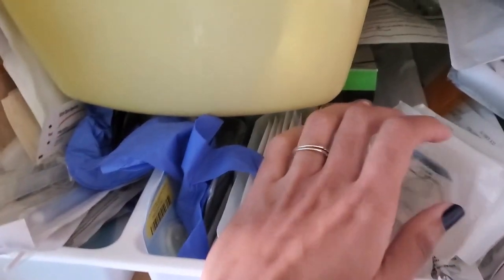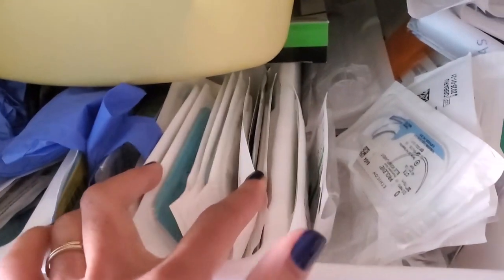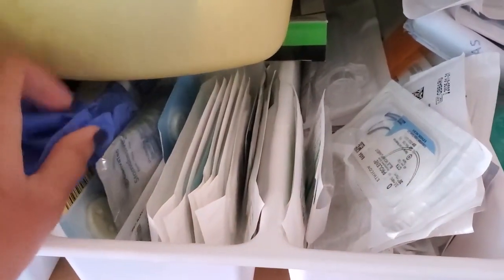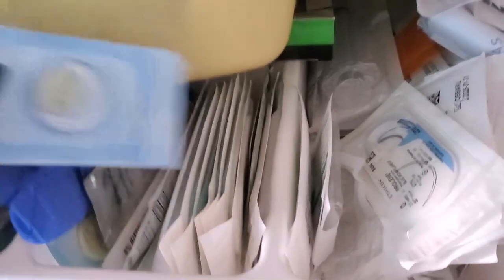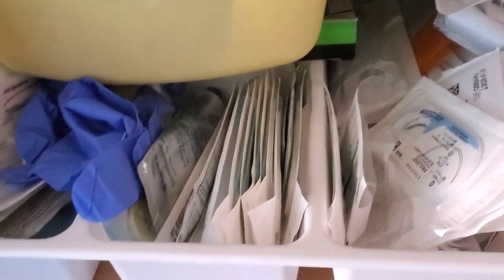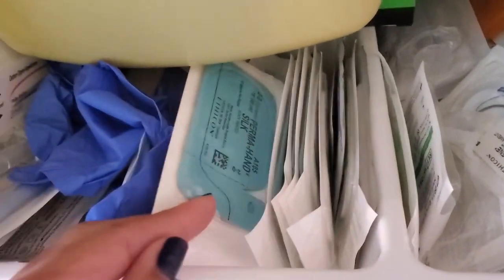If we are just trying to stop bleeding on somebody's permacath or something like that, we may put a couple of sutures in there. Then we have other larger sutures and stuff. And I want to show you guys something about the sutures, so I will get them out just to show that for you all. But it's important with those sutures to ensure that you're getting the right size and the right kind of suture.